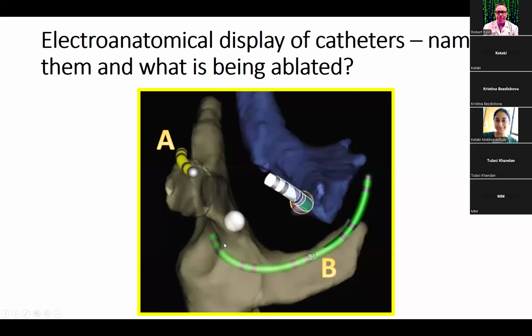This area is very difficult to ablate, or more difficult than some others. And the other one that's very difficult is over here, this area, sort of antero-lateral. And why do you think that would be harder than, say, ablating over here, Molly, to ablate a pathway over here?